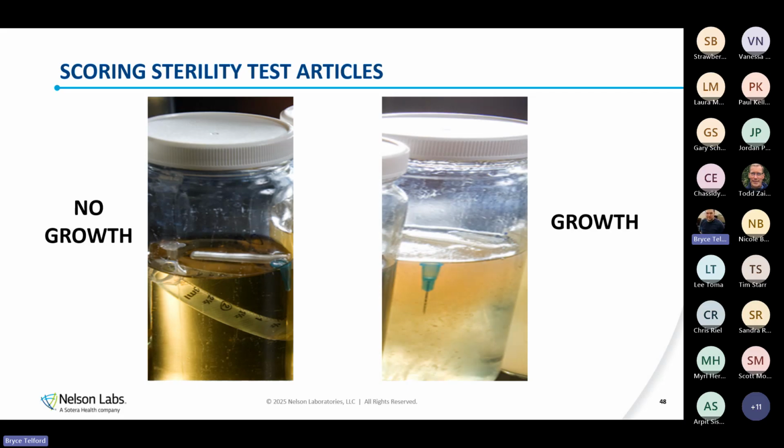So for right now, what pretty much the entire industry has done is we've bypassed the problem. So I can tell you right now, if you have a product that has a fluid pathway only claim, that's great. We're probably going to validate both inside and out.